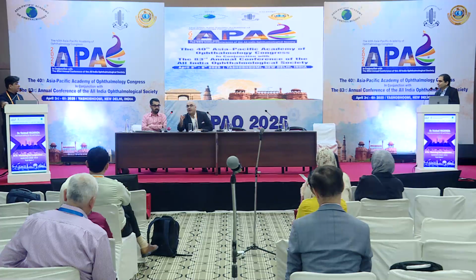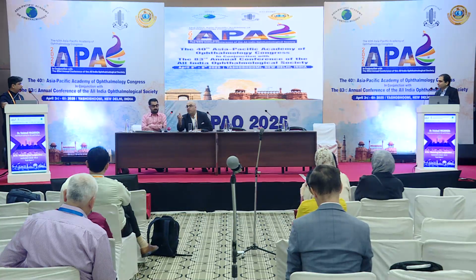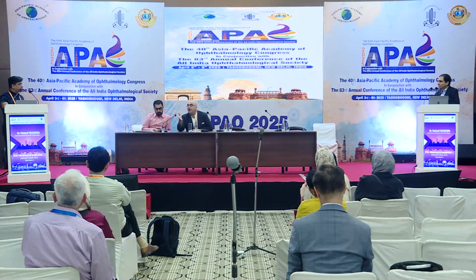So I think the advanced lenses should be used in teenagers, in whom there's an understanding of what you're doing. Very true. And people who put diffractive multifocals in children under the age of 8 don't want to talk about what's happening to their contrast sensitivity and their amblyopia. They never talk about that, but that's a real fact. So the older the child, the better. Absolutely. Thank you so much.